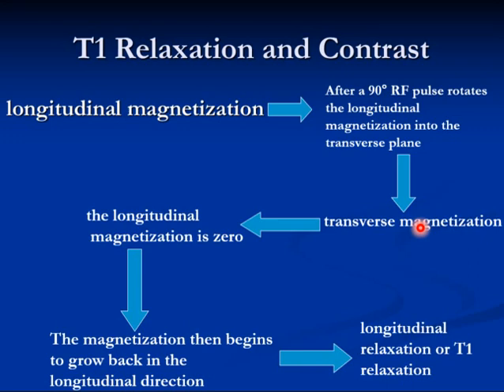This is called the longitudinal relaxation, or T1. The coming back of the protons from the transverse into the longitudinal direction is called the longitudinal relaxation. The protons, instead of being tense in the transverse plane under RF pulse control, will grow back.